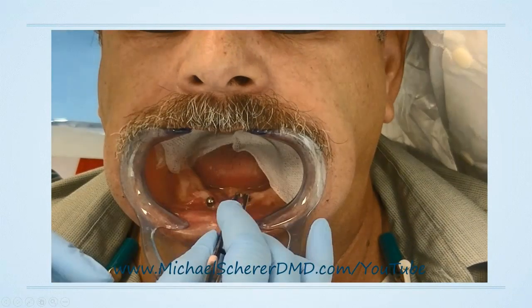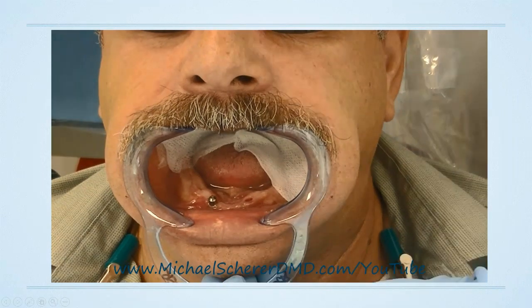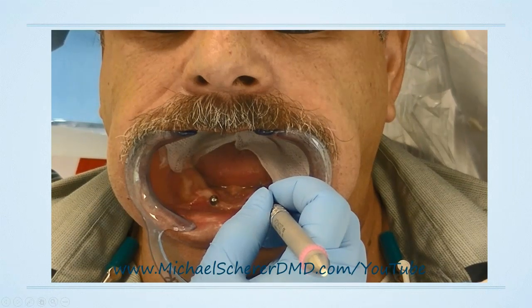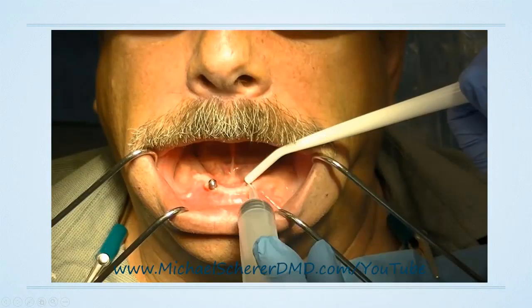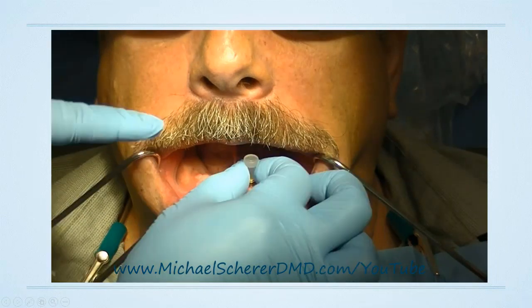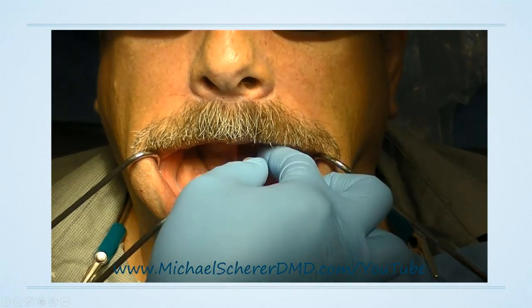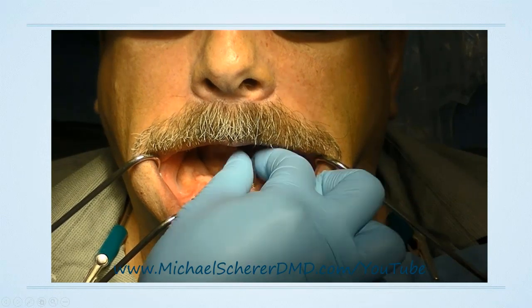Then I'm going to irrigate the implant itself, just cleaning it out, flushing it out. Then we're going to take a measurement of the soft tissue form. As mentioned before, I'm going to measure from the exterior portion of the implant to the top of the soft tissue. I got a measurement here, and that measurement is about 3 millimeters. Then I'm going to take my locator abutment, lightly screw it on top of the implant itself until it's just finger snug or finger tight.